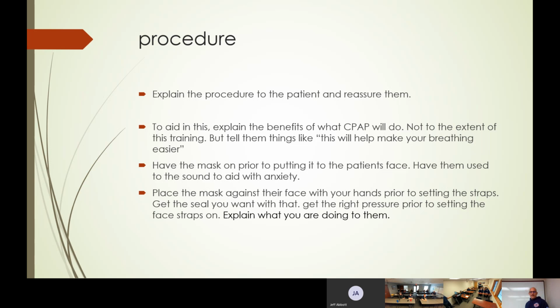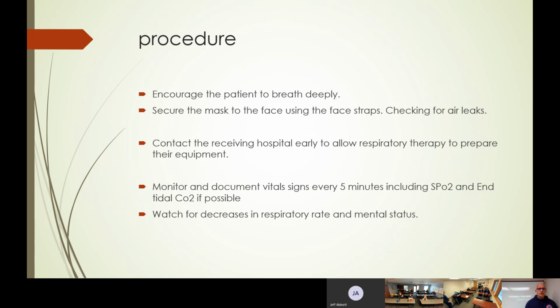Place the mask against their face with your hand prior to setting the strap, so you get a good tight seal. Say, okay, you all right with that? I had to make sure this seals up. I'm going to pull this harness over and tighten it up so that it stays on your face. Okay, just be sure that they know what's happening as you go. Encourage the patient to breathe deeply.